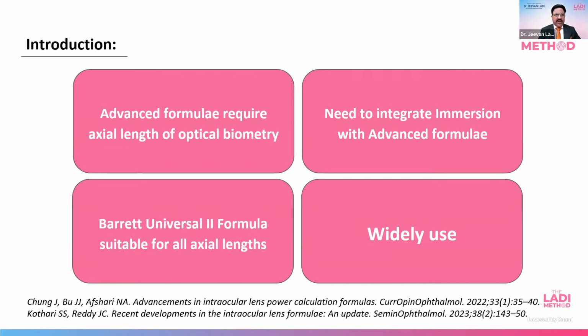As an introduction, advanced formulae require axial length input of optical biometry only. So there is a need to integrate immersion with advanced formulae, and Barrett Universal 2 formula is suitable for all axial lengths, and it is also widely used and selected for this study.